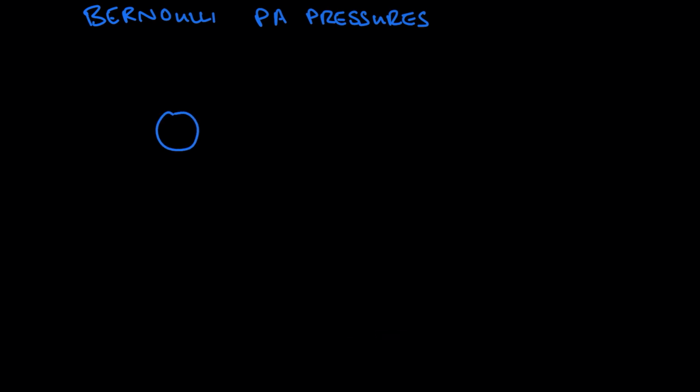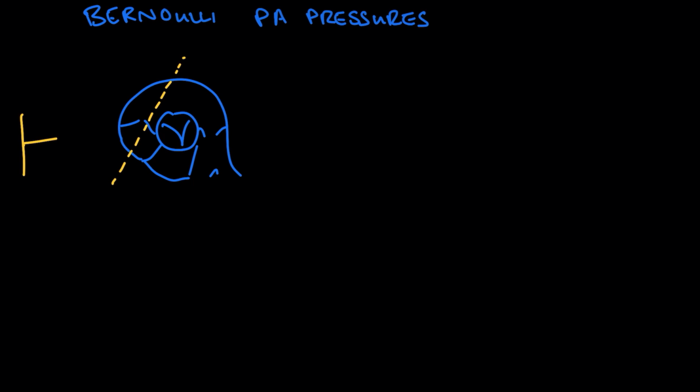We've got the Mercedes-Benz aortic valve right in the middle, and then looping around, you've got your pulmonic valve right here. And then you've got your tricuspid valve, and over here you've got your right atrium and your left atrium. We are looking in systole in this frame. In systole, you can drop your continuous wave Doppler right back there, and you may get a tracing that shows the velocity leaking backwards during systole through the tricuspid valve.